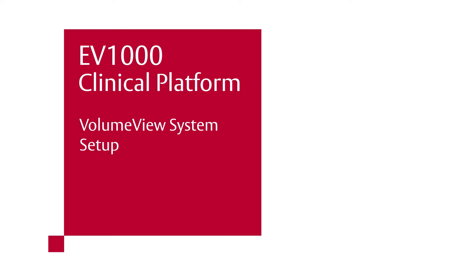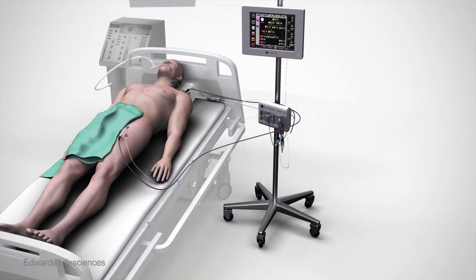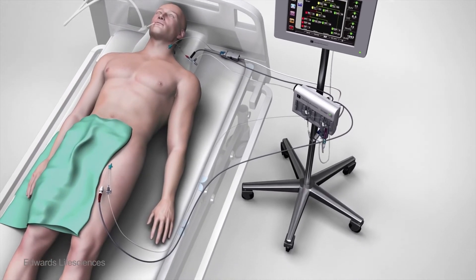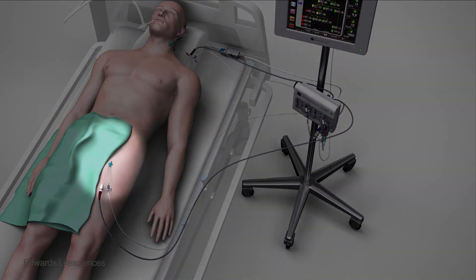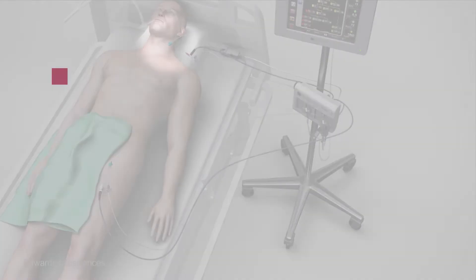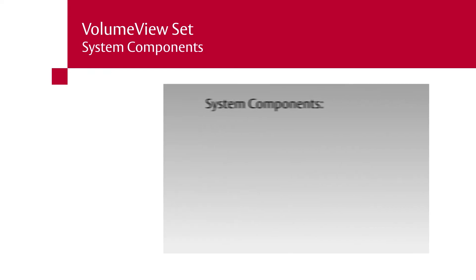Volume view system setup. Before monitoring can begin, the patient must be prepped with the following: a volume view femoral arterial catheter inserted into the right or left femoral artery, and a central venous catheter inserted into the right or left IJ or subclavian vein. Confirm that the following components of the EV1000 clinical platform are present and in good condition.